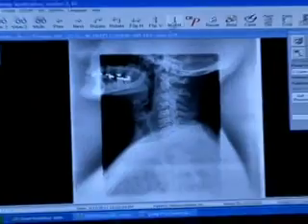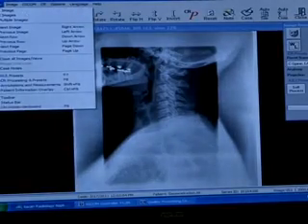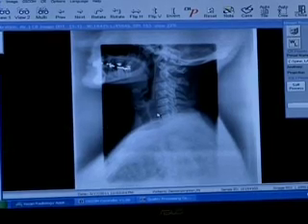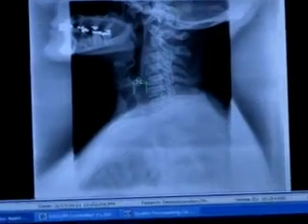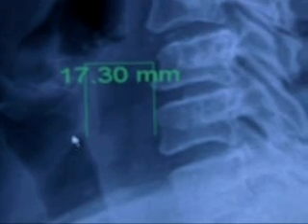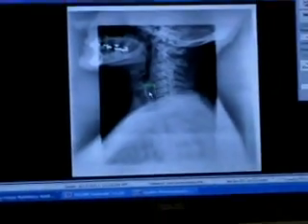And we can go back, and now we're going to re-invert it, and we can do some things like measuring. So we go to annotations and measurements, and I can measure from here to here. There are norms within the body. It'll give me, this is 17.330 millimeters. And we could change it, and these are just other clinical information which we can examine.